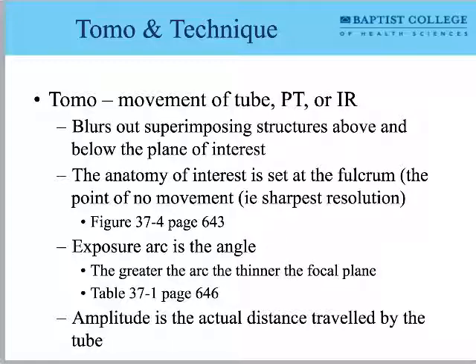You're golden, right? Every single tomographic unit that you could potentially work on will be different, and so you'll need a technologist to orient you to, this is the way that we do our measurements and things like that. Because what will happen prior to making this exposure is they'll have some kind of recipe that they'll follow where they place some calipers on the patient, they measure the thickness of the patient from front to back, right?